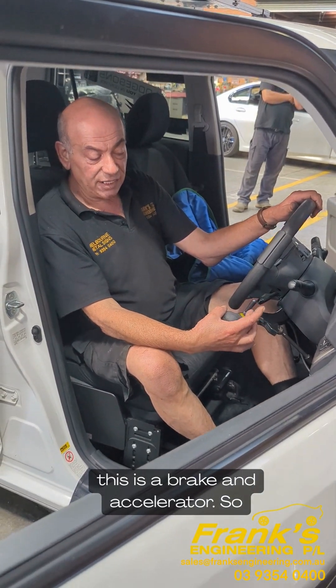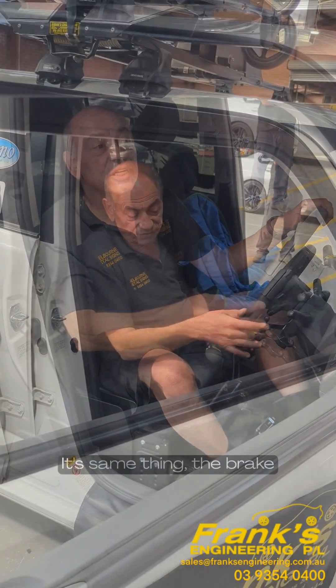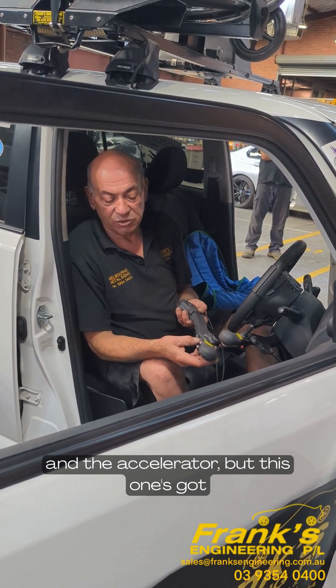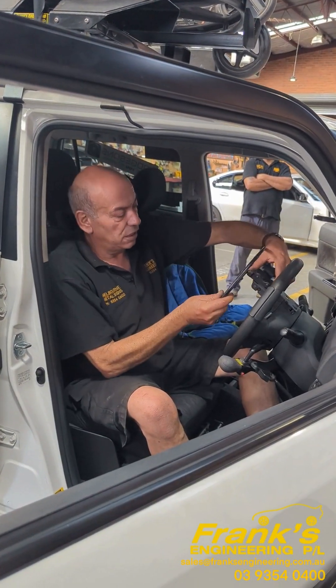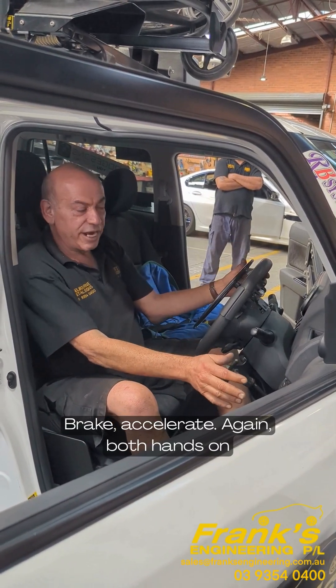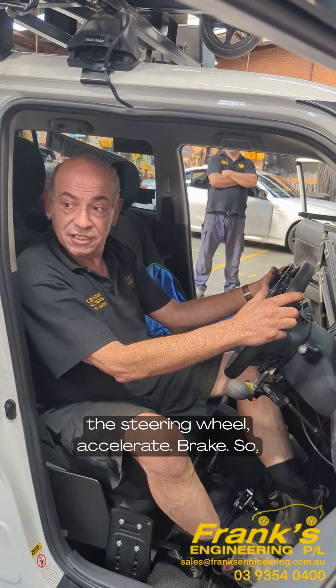This is the brake and accelerator — the 30L — same thing, the brake and the accelerator. But this one's got the indicators, ball, and high beam flash. Brake and accelerators again, both hands on the steering wheel, accelerate and brake.